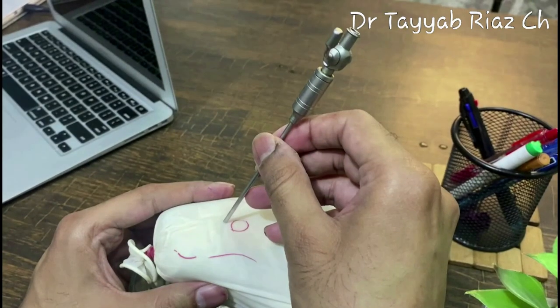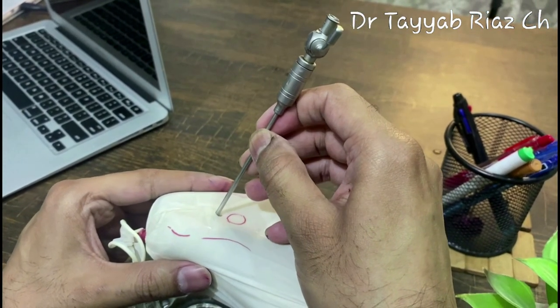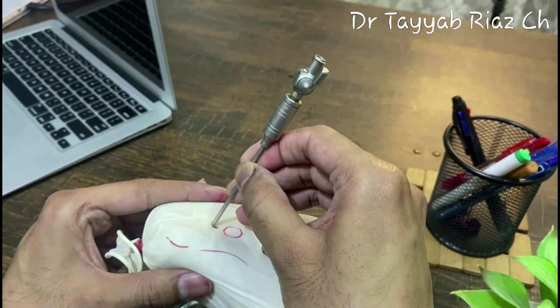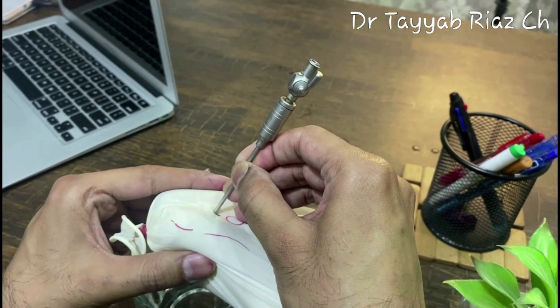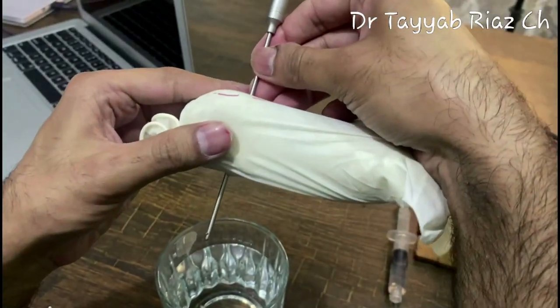Now another scenario, where after the first click sound we again experience some resistance and observe the uplifting of the stylet, and then immediately we hear another click sound and then release of the safety spring.